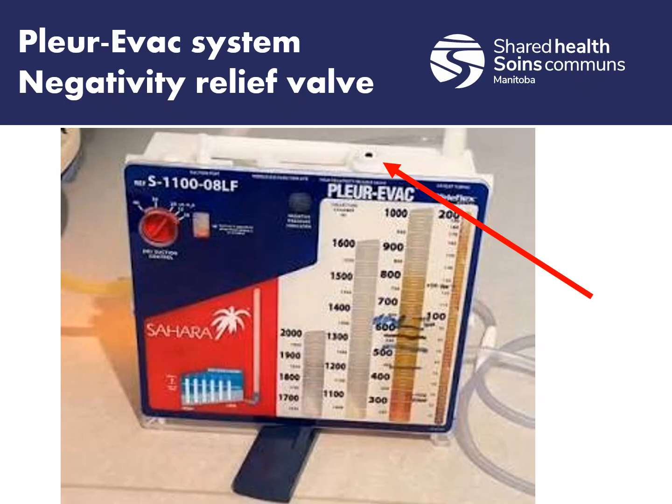So like I mentioned before, we have a negative relief valve. It's located on the top of the Pleurovac device. This is used to assist when suctioning is changed from a higher to a lower setting. Again, not a decision we'll be making. This will be decided by the sending facility or the receiving facility. When they change that negativity, the patient negativity may remain at a higher level unless it is relieved by using this valve. So basically you push it down, and it relieves that extra negative pressure.